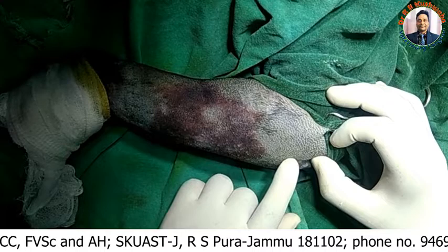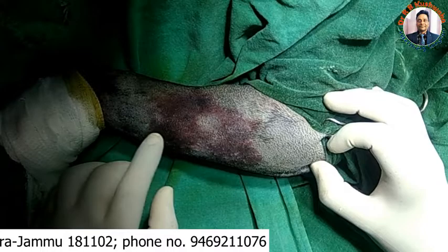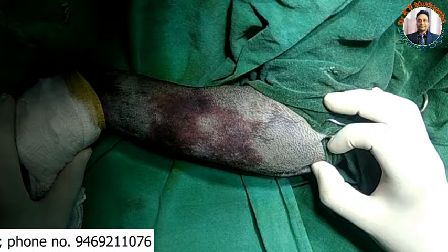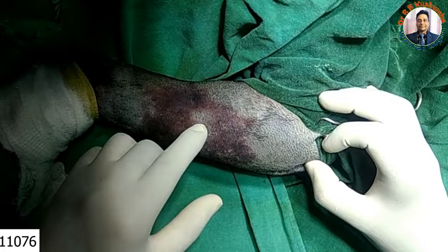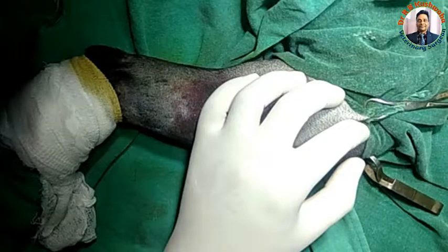After inserting the pin in the proximal fracture fragment, I will apply traction over the distal one and try to reduce with the closed method. If I fail to do this, I will make a small nick here — that is why I have prepared for both approaches. If I fail for the closed intramedullary nailing, then I will open here and do open reduction, then continue the rest of the procedure as normal intramedullary nailing.